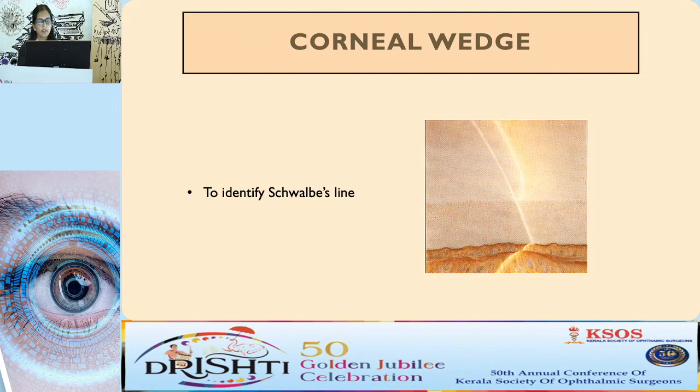The corneal wedge, the apex, can be used to identify a Schwalbe's line so that we can differentiate a pigmented Schwalbe's line from the trabecular meshwork.